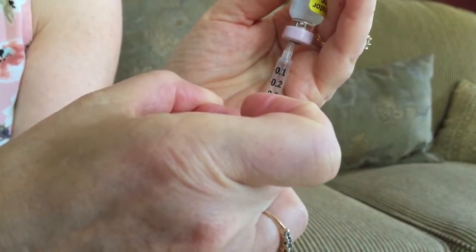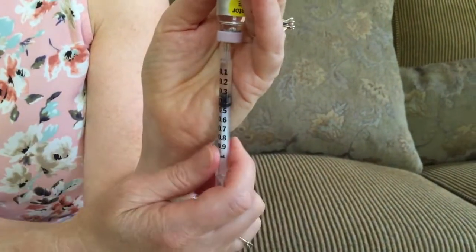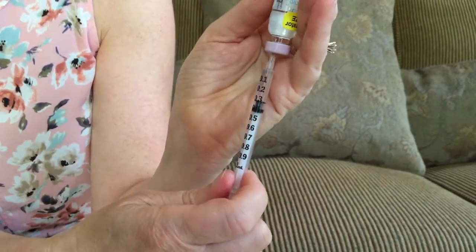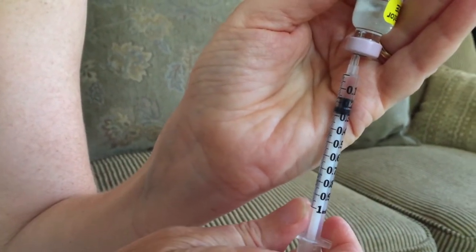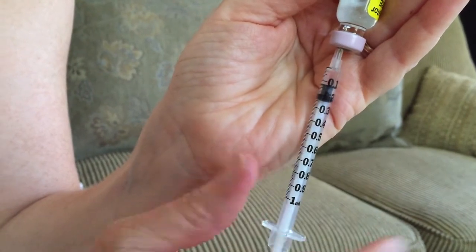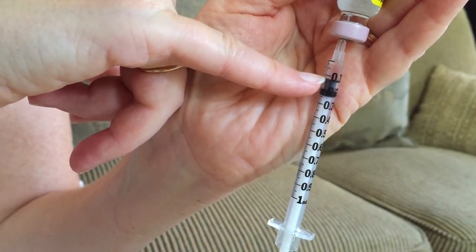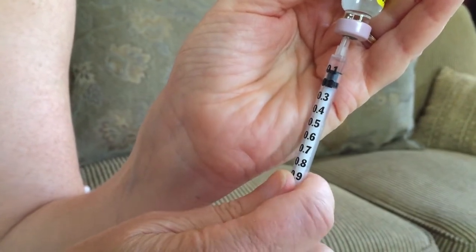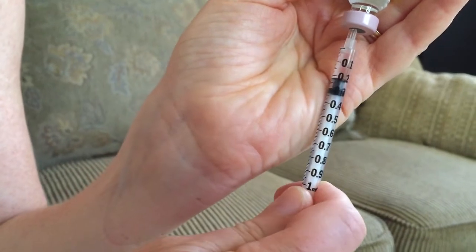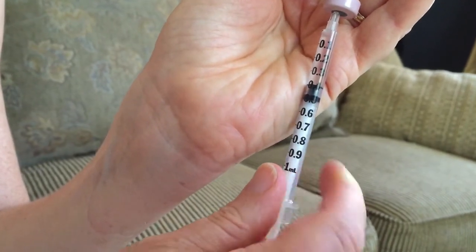Now what I want to do is get rid of any air bubbles. So I'm going to flick it with my finger. There weren't really very many air bubbles there to begin with. There's a little one there. So what we're going to do is push up, and we'll look at those hash marks, and you're going to push all the way up until you have the desired amount. You do need to know, you see this little black end of the plunger there, you want the top part to be in line with the hash mark that indicates the appropriate volume. So right now we're going to be giving the 0.1. Now let's say if we wanted to give 0.2, it would be there. 0.4 would be there.